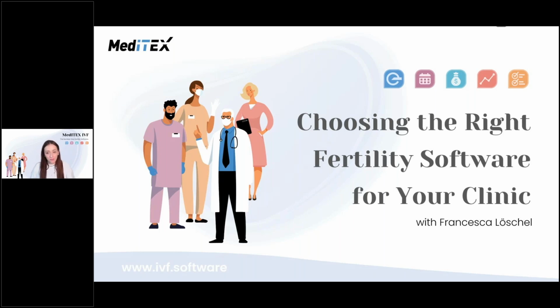So, welcome. I'm very happy to have you here for our session, Choosing the Right Fertility Software for Your Clinic. You are probably here joining for one of these reasons. Either you already use a system and you think of switching to a new one, or you don't use any and want to start your digital journey now.